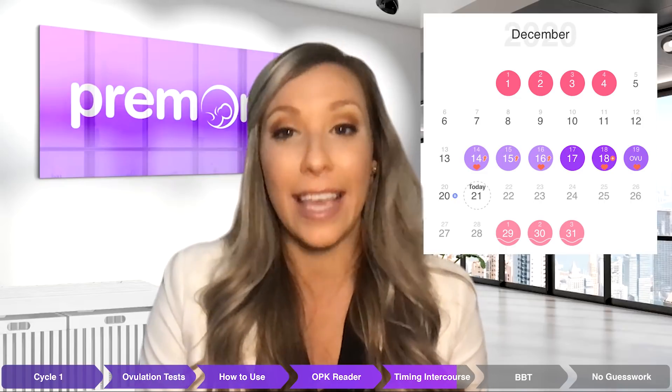Using ovulation tests with Premom, you'll easily find your LH peak and fertile window, allowing you to predict when ovulation will occur in future cycles. You will see your fertile window indicated by lavender and purple shading in your calendar and chart. Research has shown that the best way to get pregnant is to perform intercourse at least every other day for the five days leading up to ovulation and on ovulation day, which typically occurs within 24 hours of your LH peak.